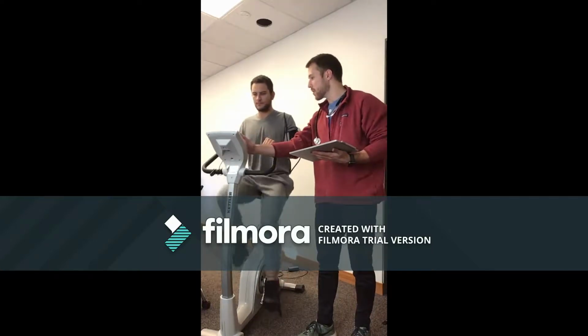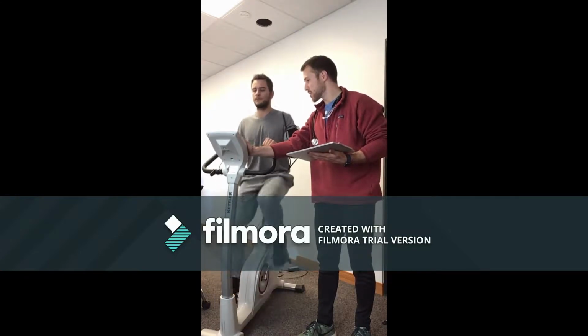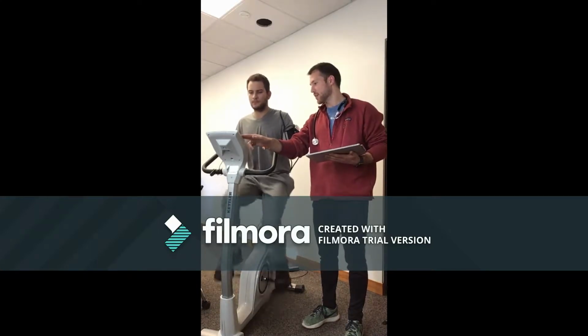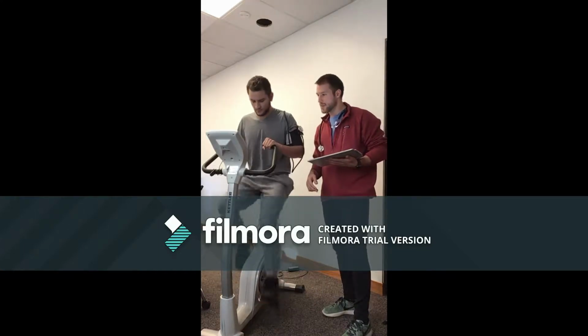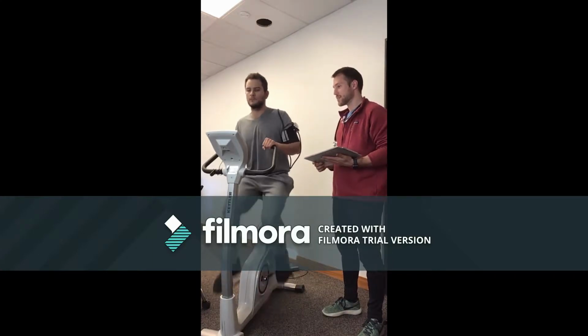So the warm-up's over. I'm going to bump you up now to 125 watts. Again, we chose that because you are also in really good shape. And I want you to maintain, if you can, that 50 RPM right here, those revolutions per minute. So keep maintaining that 50, and we're going to go for another 6 minutes, and I'll continue to take vital signs as we go.